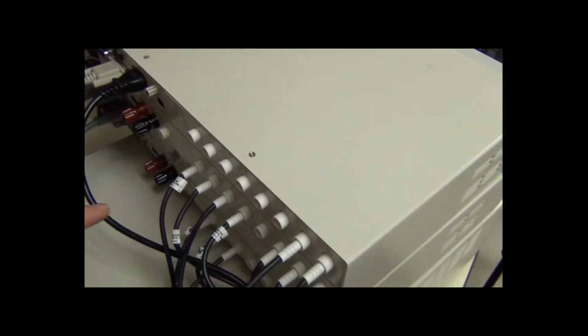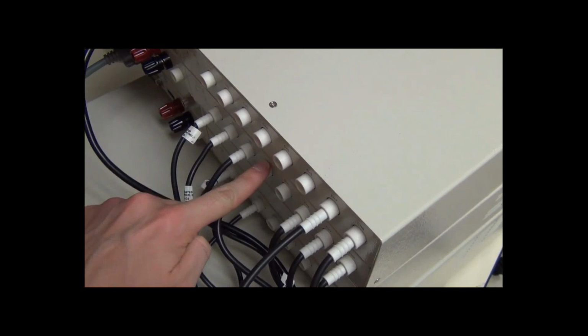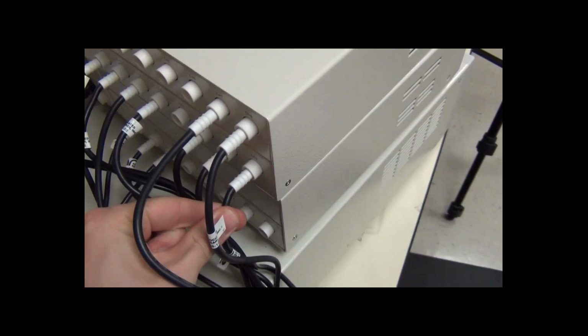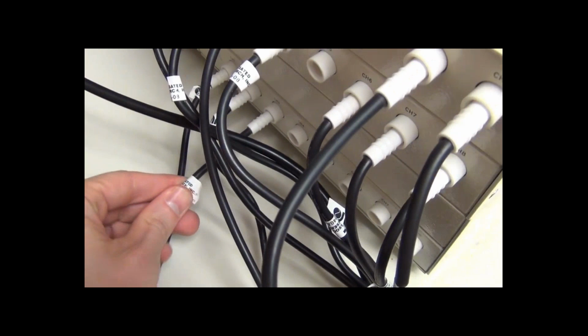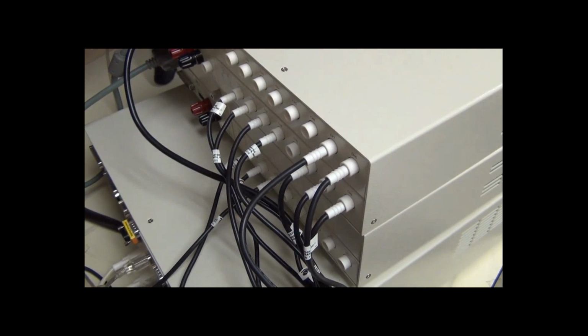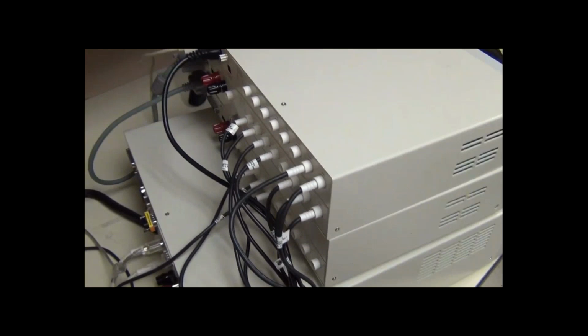Those are going back to the master channels 1 through 4, patient lead 1, 2, 3, and 4. I also have a protective earthing connection from the medical device, which is going here into channel 8 on this master scanner, as well as channel 3 on this slave scanner. And I'll explain in a moment why I'm using 2 scanners and why I have 2 PE points. But I basically just wanted to show how the patient leads are connected so that we can run this in an automated sequence.